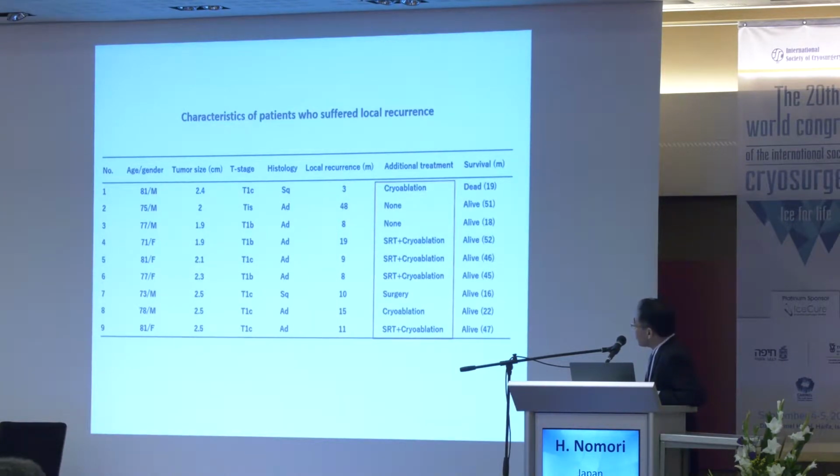This line shows additional treatment for local recurrence. Cryoablation was conducted for 2 patients, and the combination of SRT and cryoablation was conducted for 4 patients, surgery for 1 patient, and no treatment for 2 patients. And 1 patient died of lung cancer 19 months after cryoablation, but the other 8 are alive.